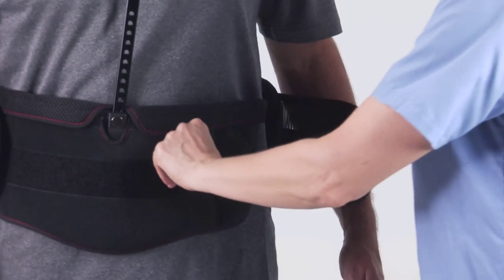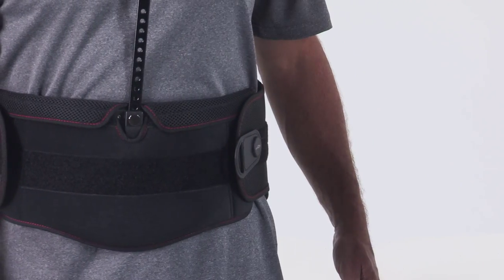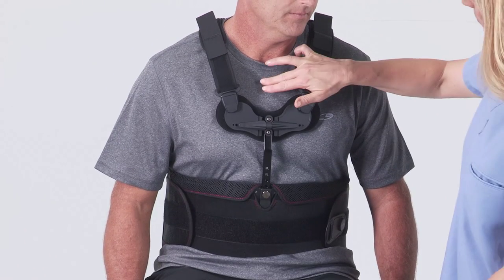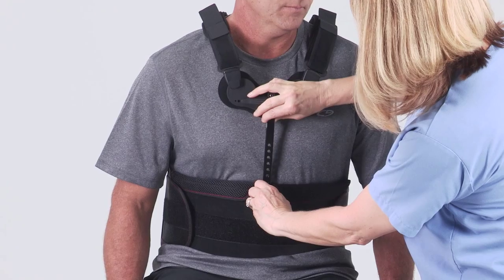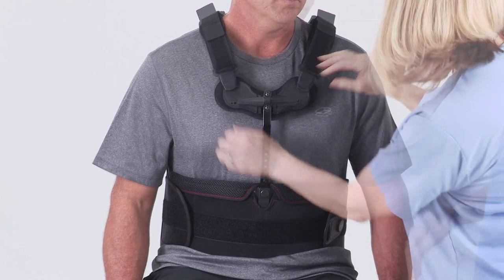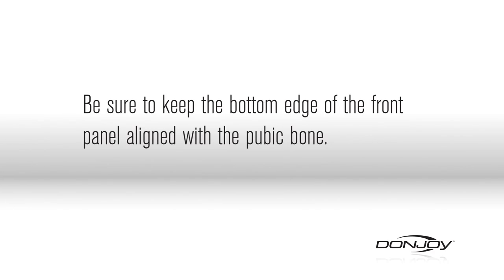Close both of the compression side panels so that they are even and comfortably snug on the front panel. Adjust the sternal Y bar by pulling up on the release button to release the sternal bar lock. Slide the sternal Y bar into position so that the top of the sternal pad fits half an inch below the sternal notch. Be sure to keep the bottom edge of the front panel aligned with the pubic bone.